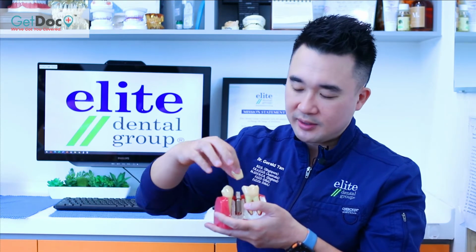Then after the surgery, we move on to the prosthetic components, which is the abutment or the crown. And these components are actually made in the dental lab. They're not usually made by the dentist. So the quality of the dental lab also matters, because these are custom-made components that are like a screw within a screw. If you can imagine, if the screw or the abutment isn't made well, and if there's a poor fit, or if the crown isn't made to have a proper fit, all these things would lead to failure of the prosthetic component.